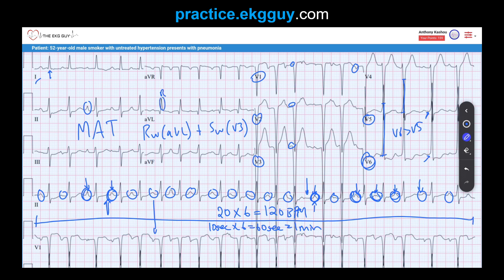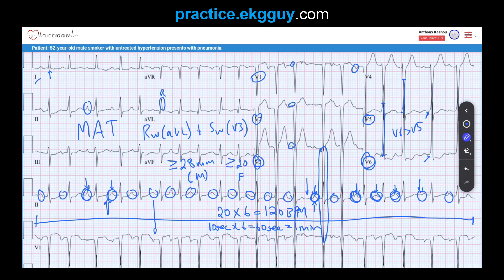Take the R-wave in aVL and add it to the S-wave in V3 — which is quite large here. If the sum is greater than 28 millimeters in males, that is suggestive of LVH. For females, the cutoff is greater than 20 millimeters. Our patient is a male smoker, so we're looking for the 28 mm cutoff — and it is clearly met in V3 alone. LVH is present by the Cornell criteria.